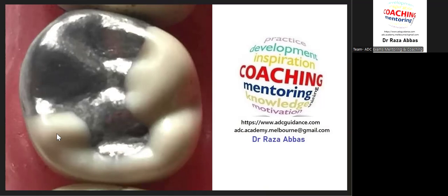fit yourself in the way you can. No one is looking inside what you're doing in the mouth. The examiner is not standing on your head. They are just going to take your jaws after the exam for assessment. How you create it, what you do, does not make any difference. The outcome matters. So your thinking should be, I want to achieve the outcome. If you are able to achieve it following stepwise pattern, everything goes fine. Okay, that's fine. But if things are not going fine, you have to work your way out, right?